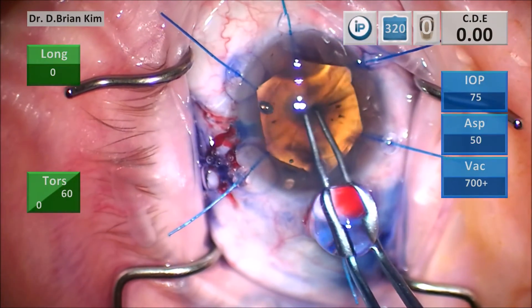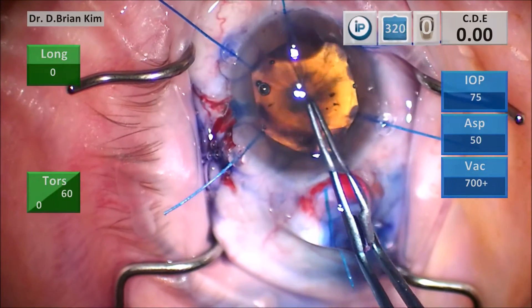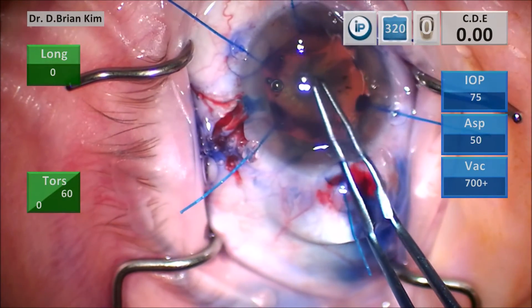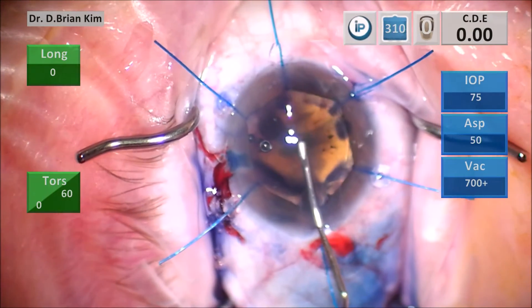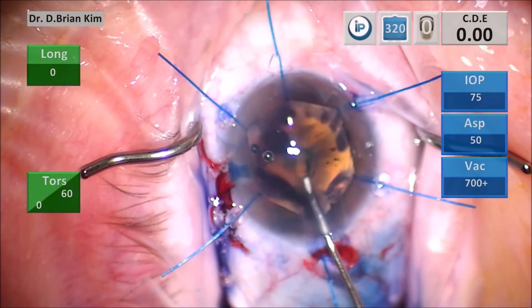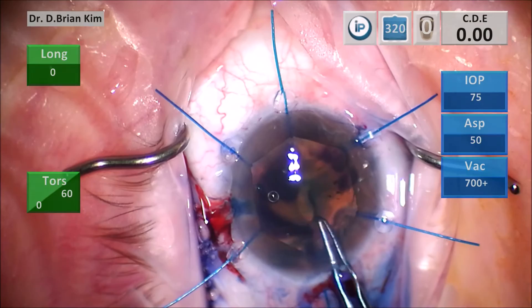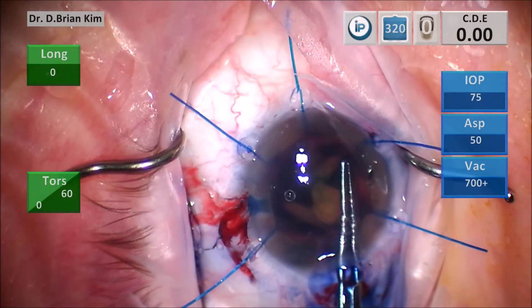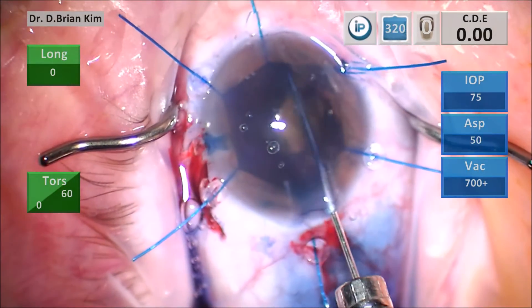Once I'm starting to perform capsulorrhexis I'm finding that all that's happening is capsular striae — I'm not able to puncture it because there's no zonular counter-force pulling the zonules centrifugally. So I went ahead and punctured centrally with the cystotome needle. With loose zonules, if you don't have enough counter-force to keep the capsule on stretch, this can be a problem — however in this case it was okay.